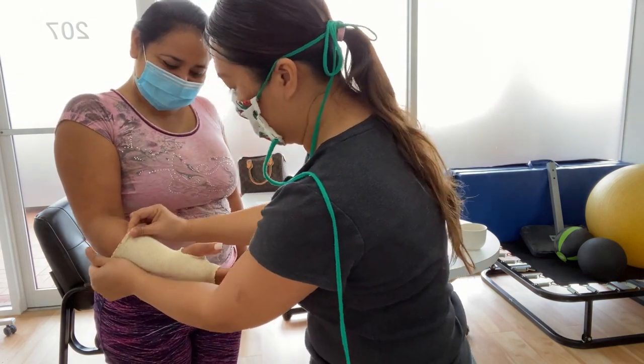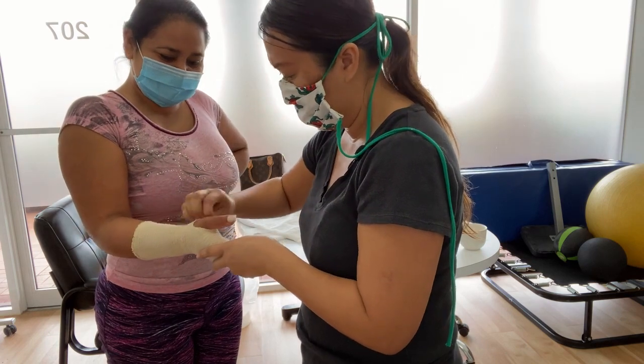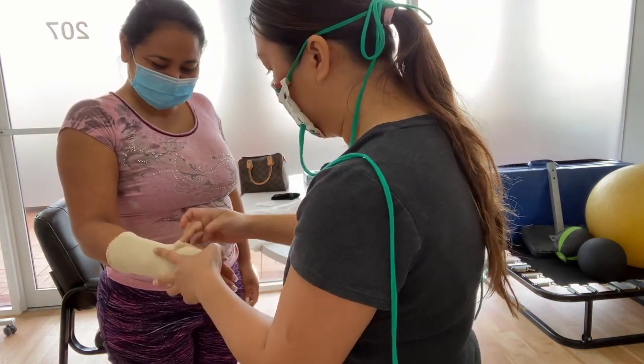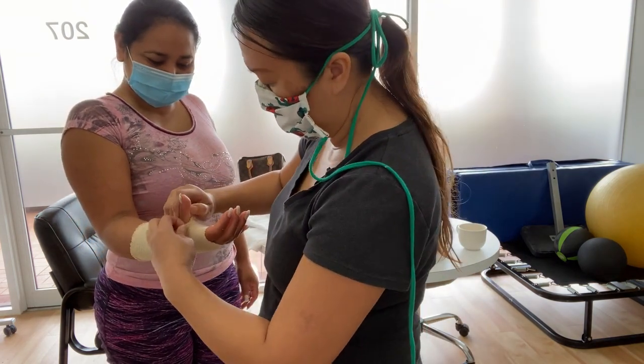See how easy it is? You don't need those. And then you just shift it around. I always like to make sure that the thumb piece is not cutting off the circulation.